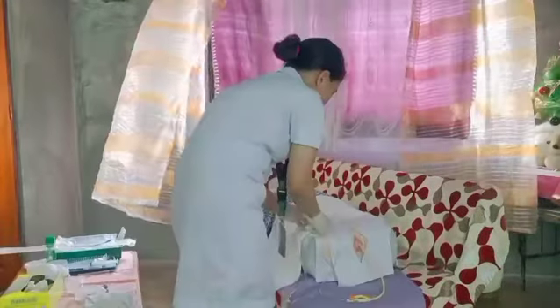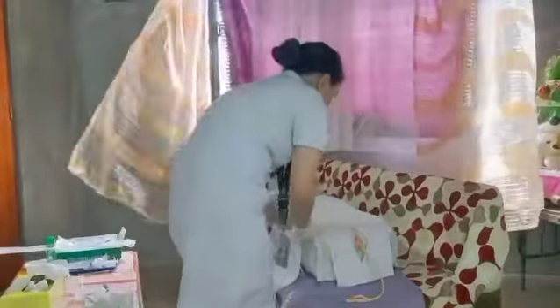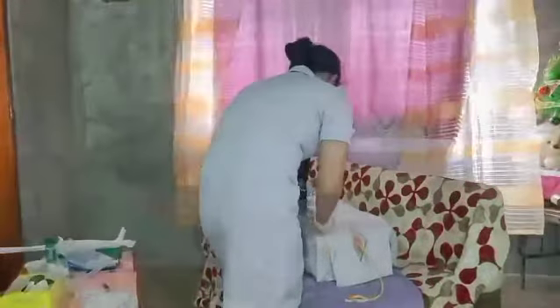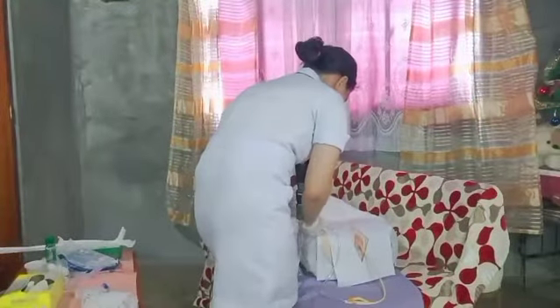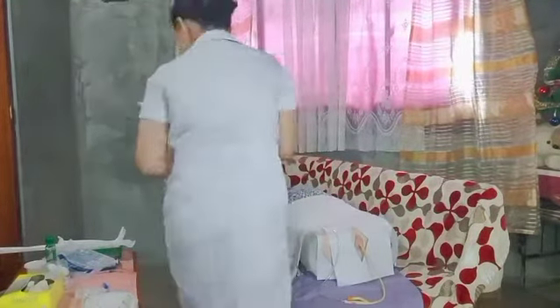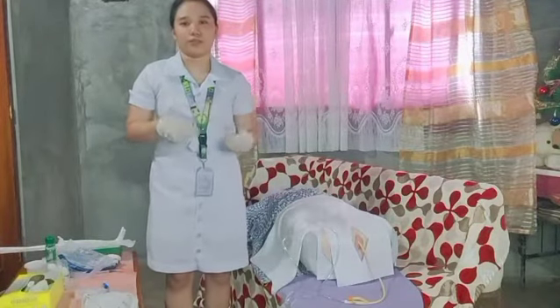So that's how we insert a female catheter.